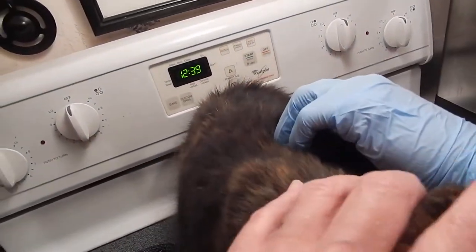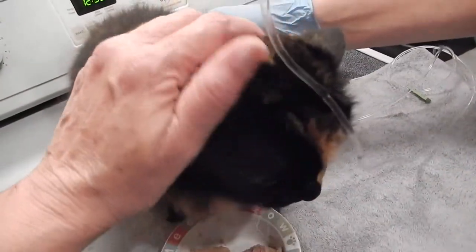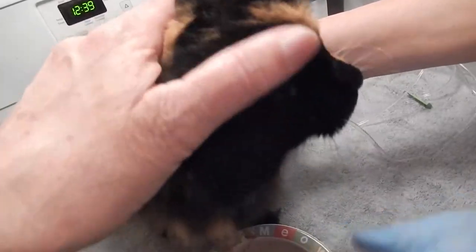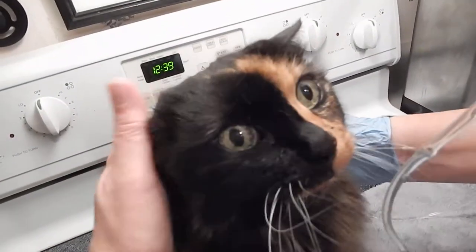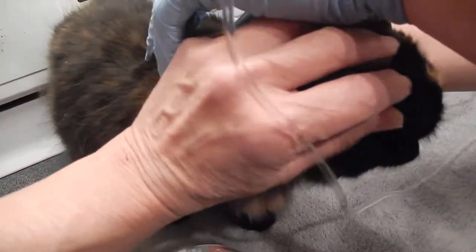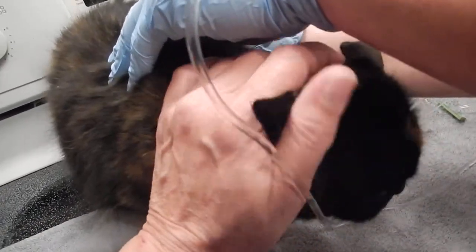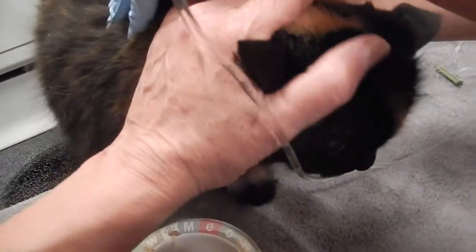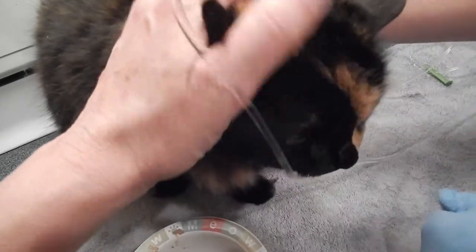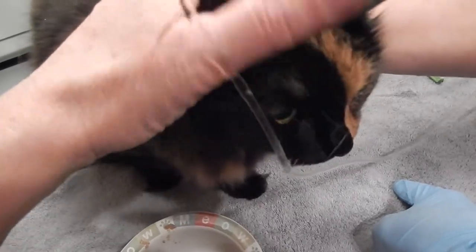Almost done. We don't have to give her everything, but almost done. The reason why she's crying is it's not the needle so much as it is the fluid. The fluid right now is about room temperature — about 70 degrees — and her body temperature is about 98, so it doesn't feel very good going in. She's doing okay.